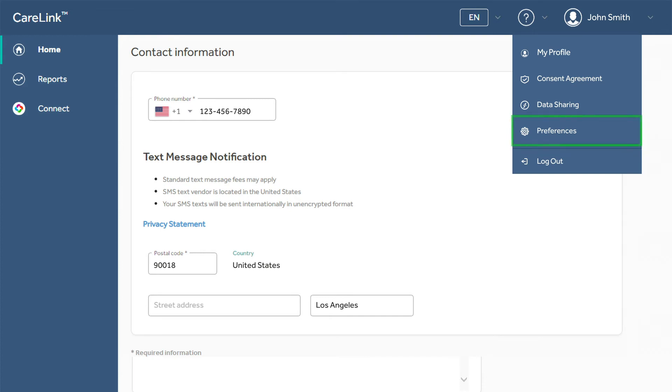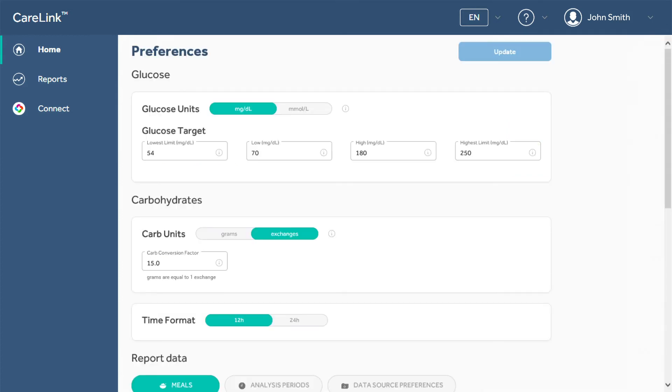In Preferences, you can customize the way your reports display your data. You can adjust glucose information, carb information, and time format.